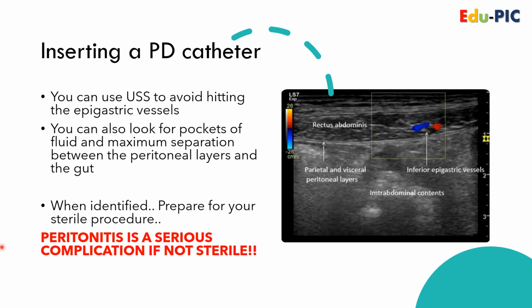You need to remember that you're putting a drain or a catheter in the peritoneum, and if it's not sterile, then you can cause peritonitis, which is a very serious complication.